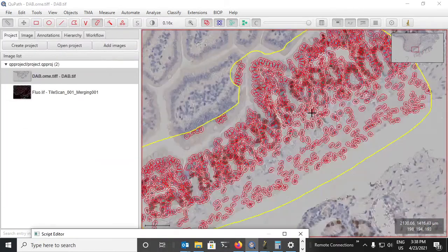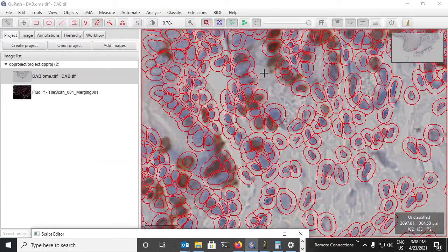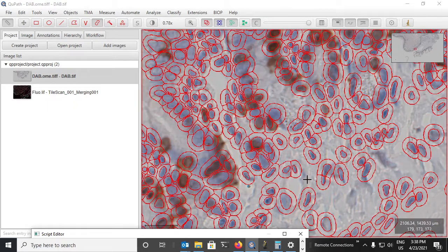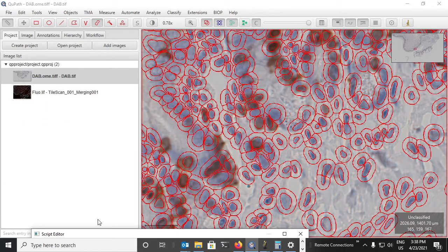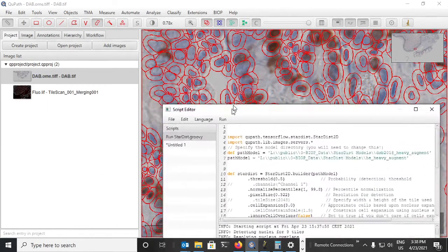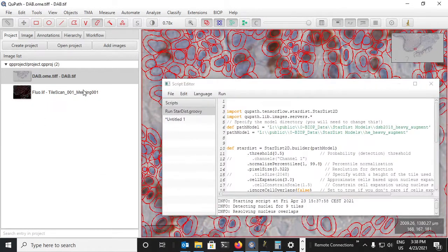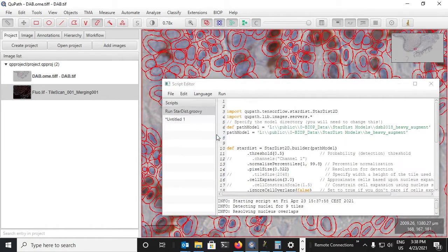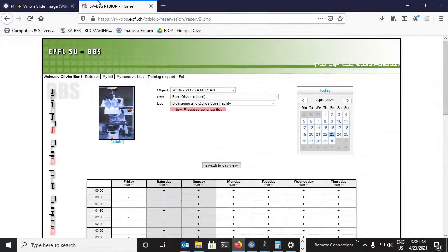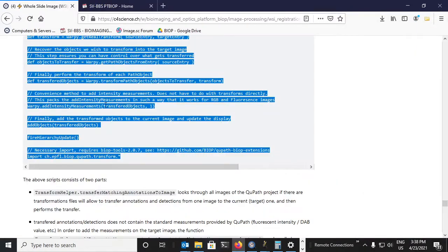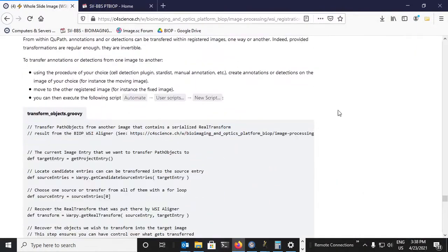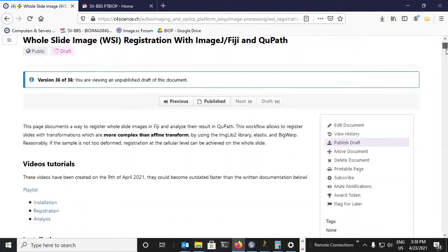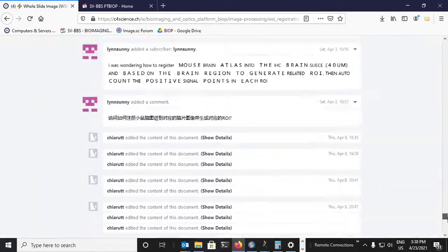There, so now we have some fairly good detections, not excellent but fairly good. And we want to transfer these onto the fluorescent image. All I need to do is switch to the fluorescent image, go to the tutorial here where we were before.